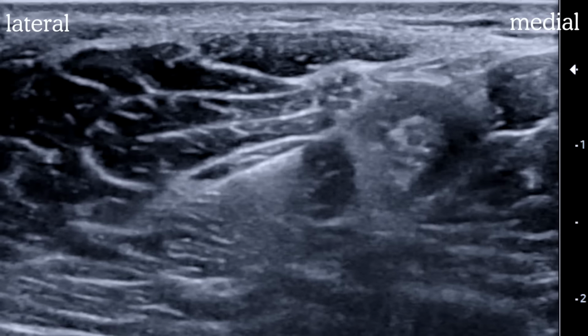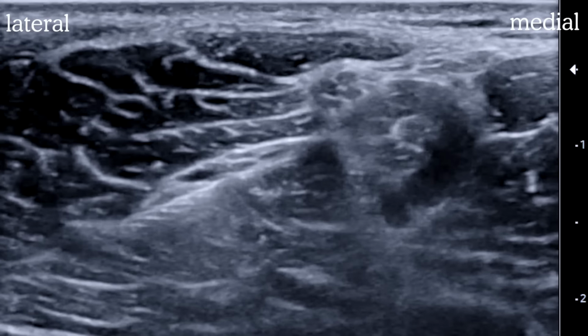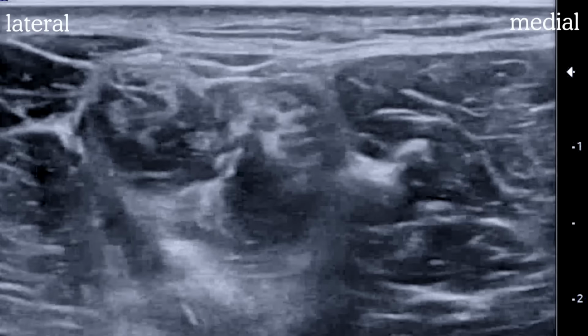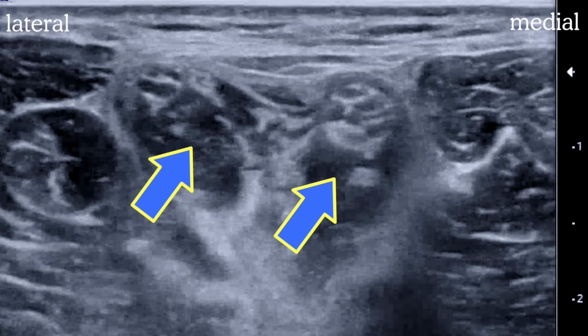Don't worry. Remember the pants analogy. If you're inside the pants, the volume will backfill and then go down the other pant leg. After the injection's finished, I like to scan distally to confirm that there is indeed local filling both pant legs.